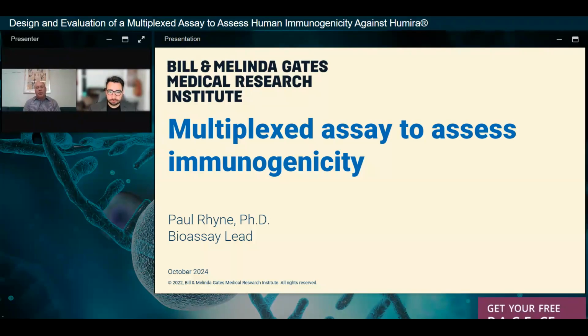And with the Luminex assay, it's about the same. And the advantage is that with that small amount, you can get all of the isotyping done as well as the screening assays with that small amount of sample. So that is a definite plus.